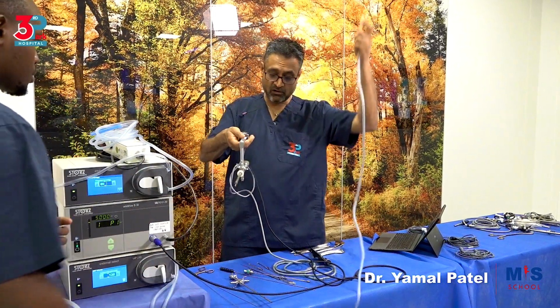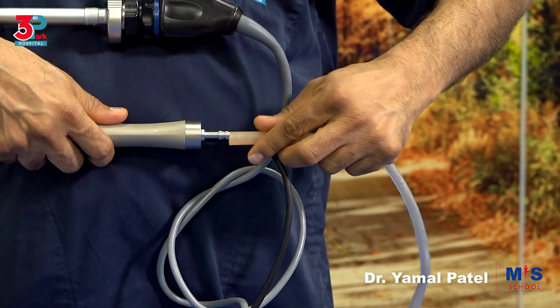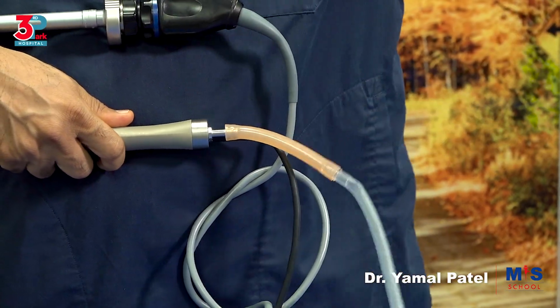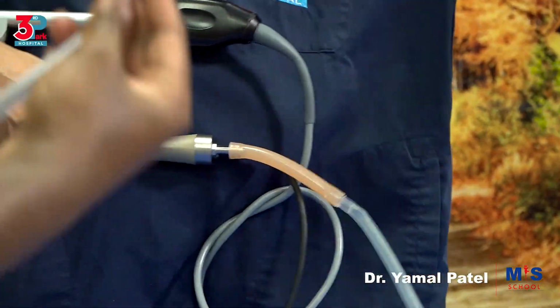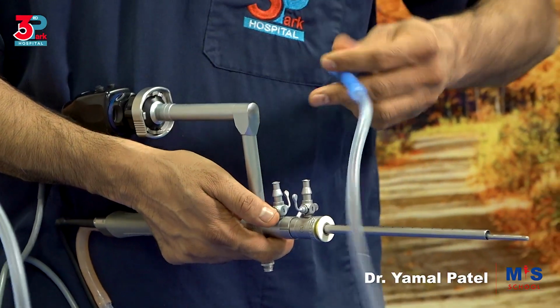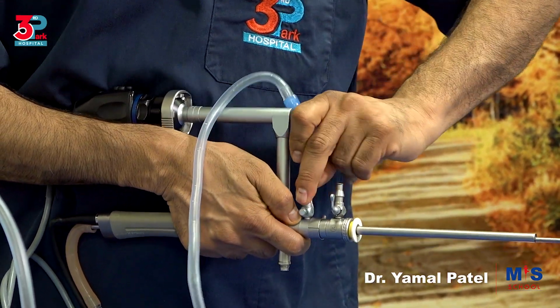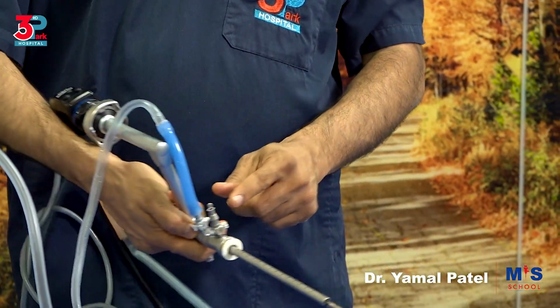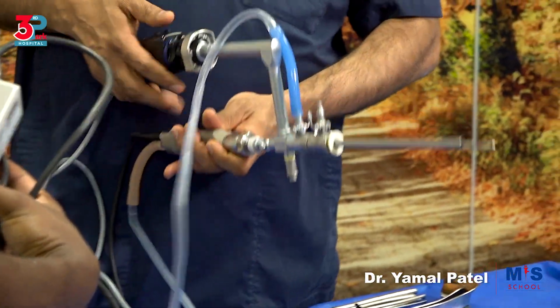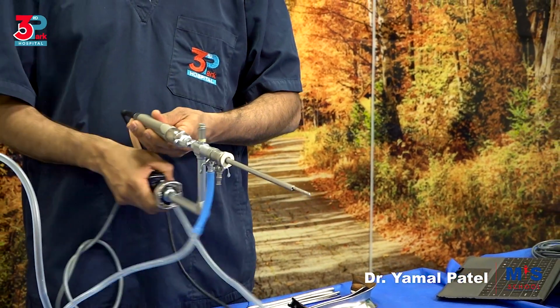We have the fluid suction that connects to the back here. That's going to be now getting your tissue out into the suction machine. So this connects to the suction machine. And the in, remember, as with all other settings, is the one that's closer to you. So there are two here. The in is closer to you. So connect that. When it's open, it's always in line with the tubing. So this is open. So this is a setup that is ready for shaving.